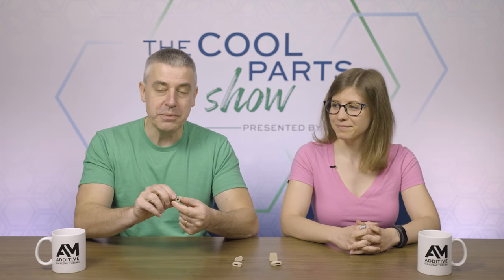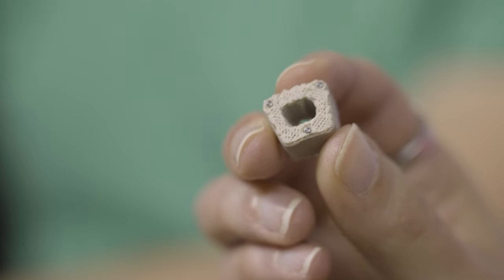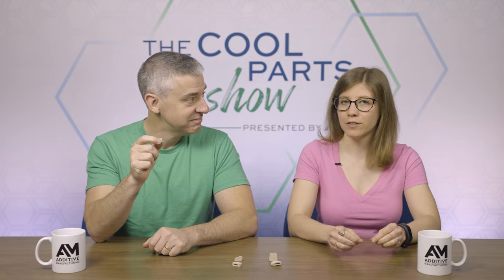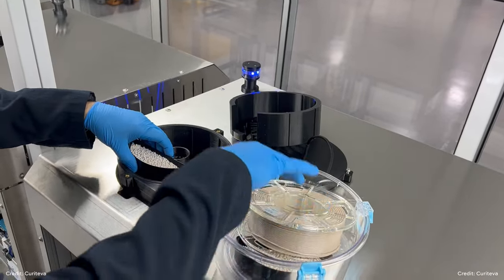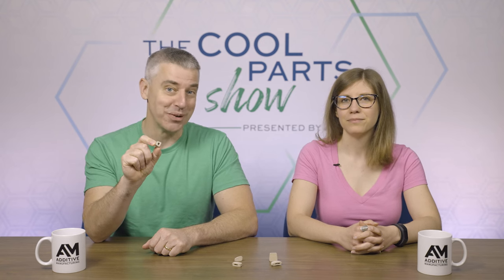This is a 3D printed spine implant made of polymer, not metal, and it's been approved by the FDA. It's also our first implant to be featured on the show that is made through an extrusion style 3D printing process. Fused strand deposition of PEEK on this episode of The Cool Parts Show.